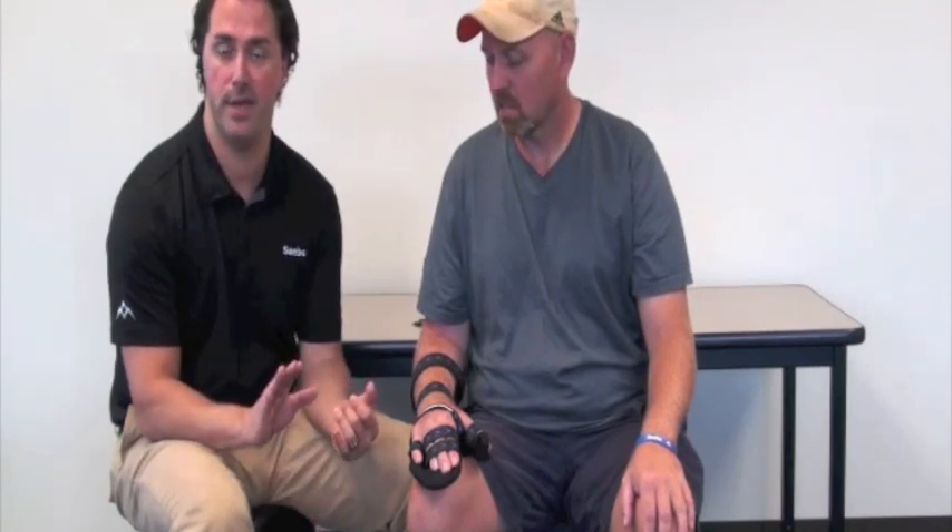We can either lower the wrist mount angle — right now it's at plus five — down to neutral or maybe minus five. Or we can switch to a weaker hand plate. When we do the exertive test, we're going to see if the fingers stay put. If the fingers start to pull out of the original position because of tone, we'll either drop the wrist mount or switch to a weaker hand plate.